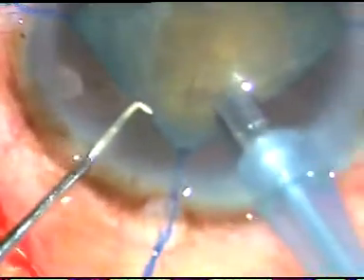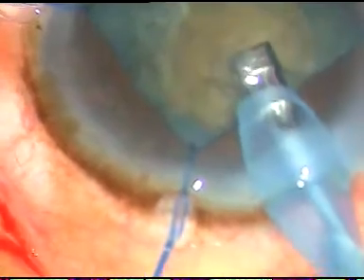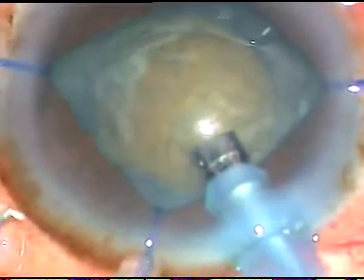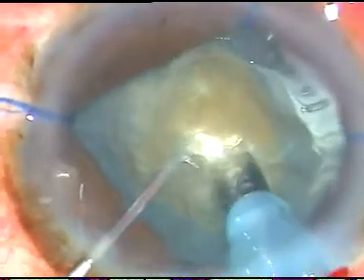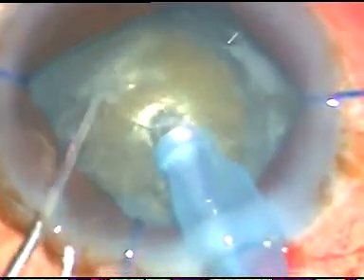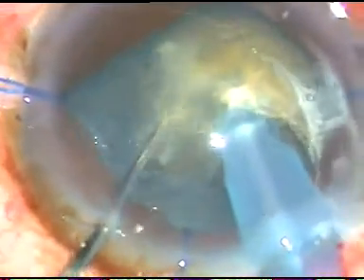Bevel down, gently glide over the iris, then go downward and rotate the phaco tip with the help of the left hand. Now I am going to go into the nucleus, bury the tip with full continuous energy, and go forward. I call it the submarine technique. This is similar to the oat cutter technique described by Doctor Vikas Mahatme of Mahatme Eye Hospital and Eye Bank.